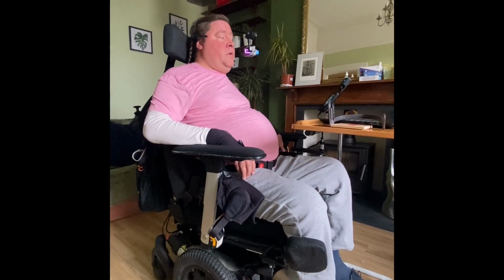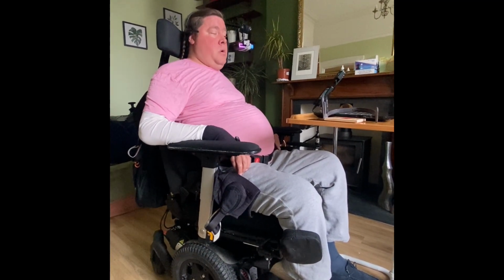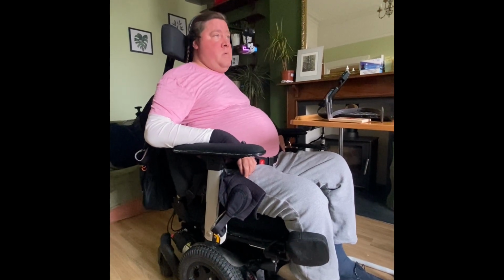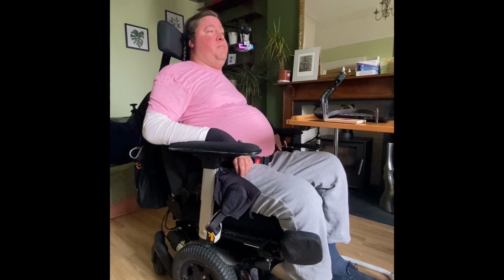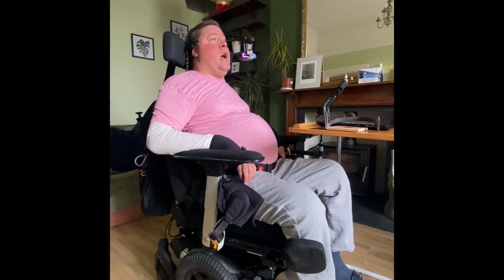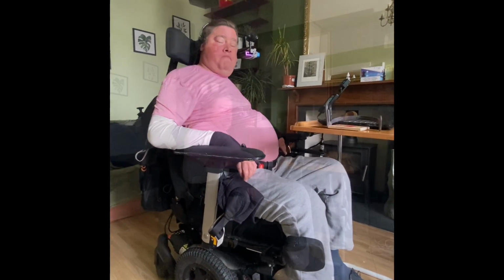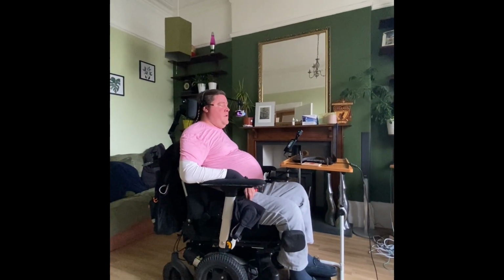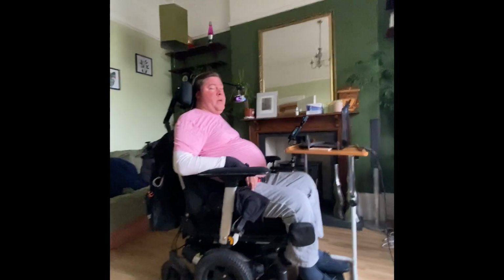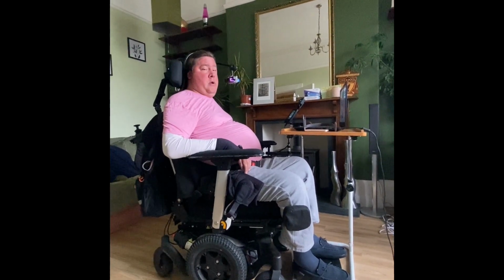And then I have finally developed a Boid swarm simulation system that allows for multiple mobility solutions to be mapped on the same display, essentially preventing any collisions if there are a number of aerial mobility devices in use at the same time. In my artifacts, I have submitted some Python code for a robot bridge and an aerial mobility system, and I will first take you through how to set up and implement those two programs.